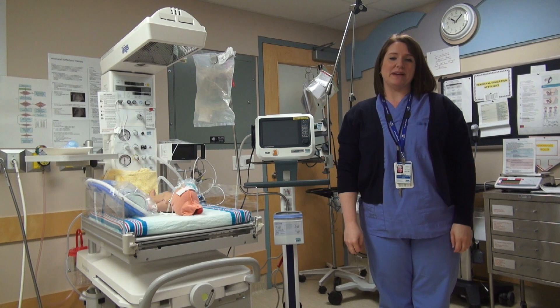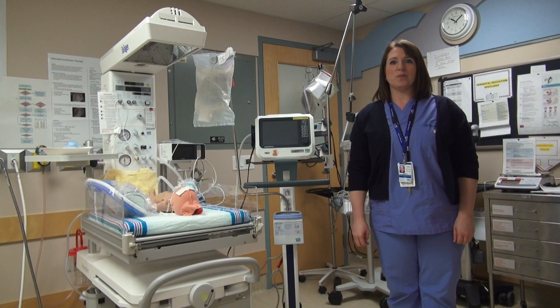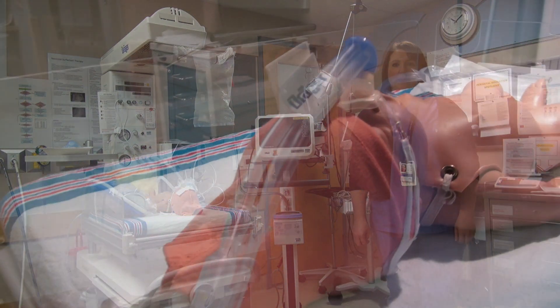Hi, I'm Danielle, Perinatal and Pediatric Nurse Educator at West Coast General Hospital. In this video, we will be reviewing the usage of the Hamilton CPAP vent in LDRP.